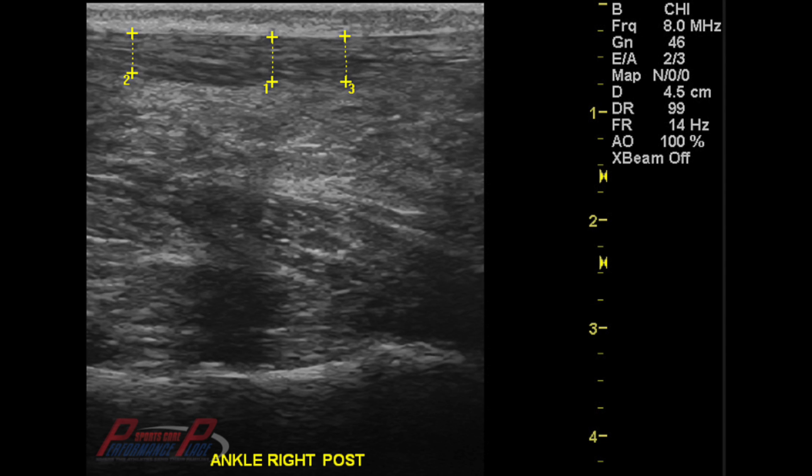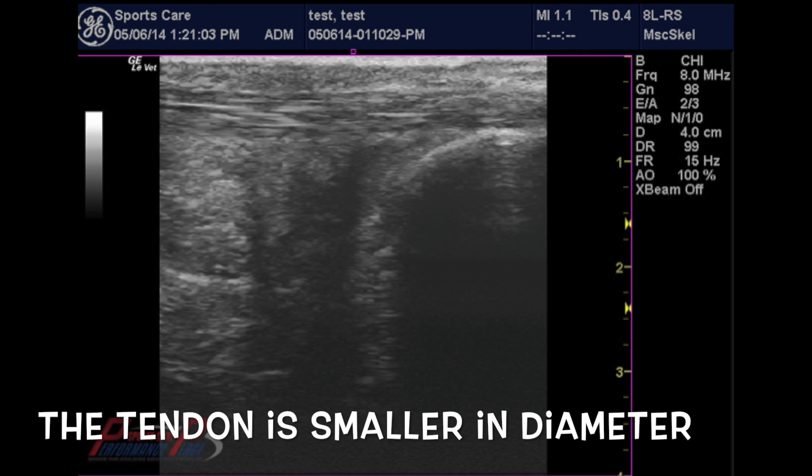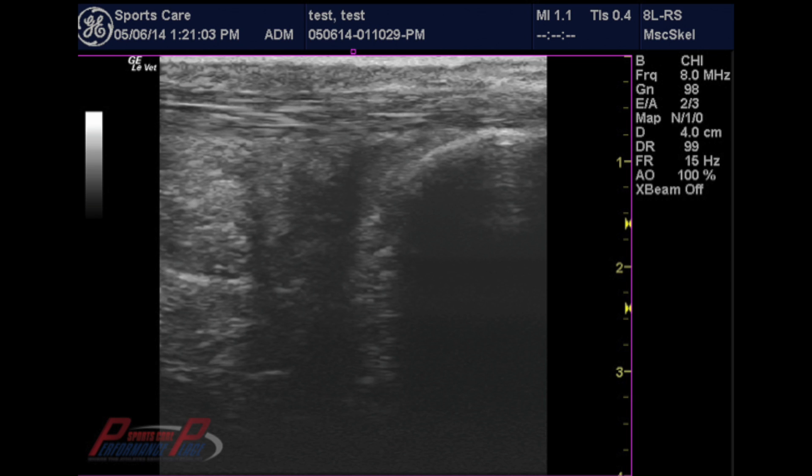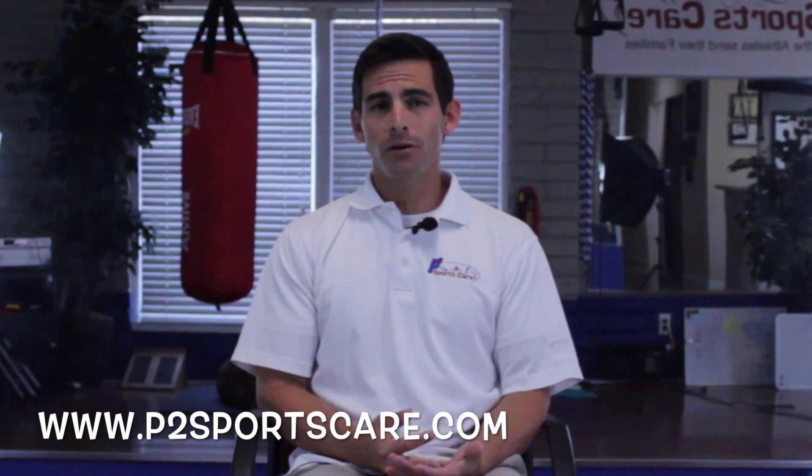Now looking back at the normal, I want you to see what a normal looks like again. It's very clear to see, and it's very confirming for the patient to see these changes. That last person was blown away by how big it seemed on the image. It's always important to show the patient so they're more compliant, and we can do this right here in the office without having to refer out for an MRI. This is very accurate — about 95% roughly. MSK ultrasound does have good value in diagnosing and ruling in and ruling out Achilles tendonitis.